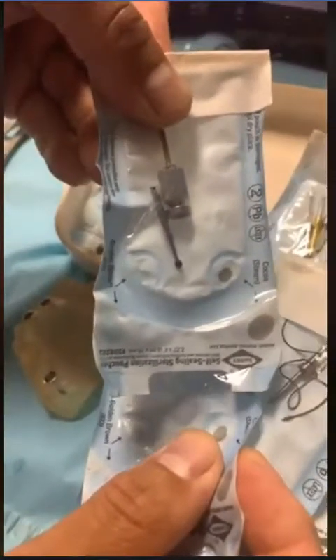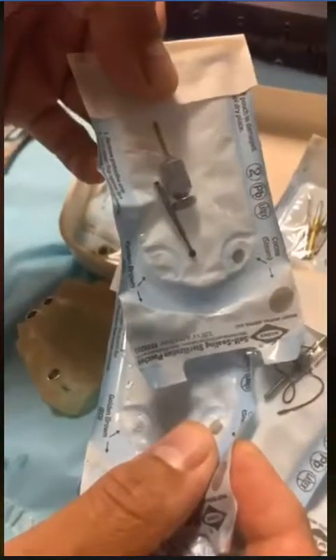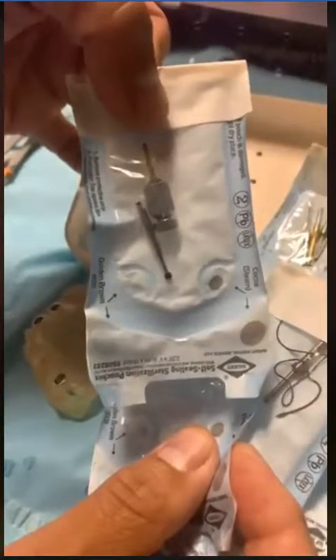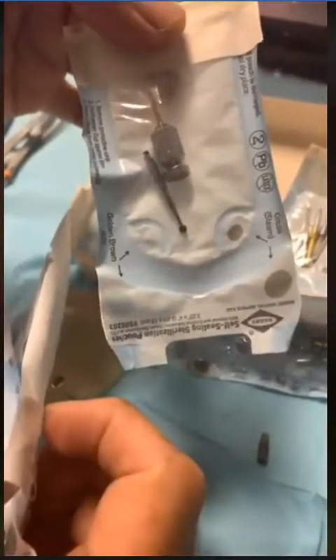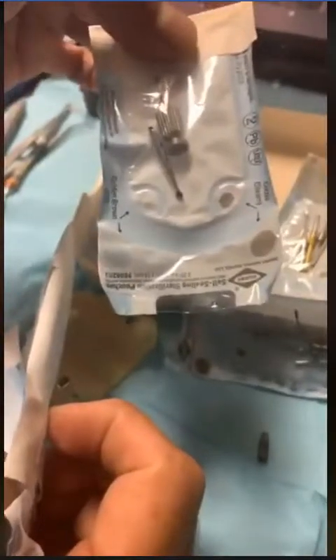And we have a bunch of other paralleling pins, and a special driver from Nobel. I actually like this one better. It fits much better to the Blue Sky Bio healing abutments and so on and so forth. It grabs so much better onto their stuff. So I have that in here, and I use this. And a round burr, this is just to go ahead and clean up the socket after you do an extraction and things like that, which does not come in this kit. So I definitely recommend that for you. So you have these guys in here.